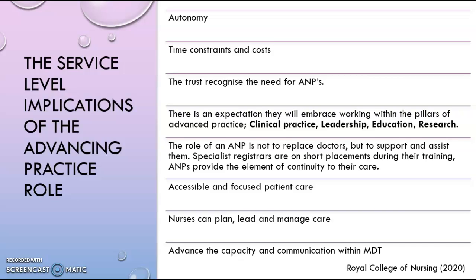The availability of ANPs in the day-to-day running of fertility clinics makes care easily accessible for patients, as the ANP can complete and assess the ultrasound scan. Additionally, on completing the ultrasound scan, the ANP can plan the next step in treatment with the patient, ensuring that care is patient-focused. They can discuss their recommendations with other ANPs without requiring a doctor to attend. It is important to emphasise that complex issues can be discussed with members of the multidisciplinary team. Furthermore, an experienced ANP can enhance MDT working, as in the absence of a doctor they can make clinical decisions in patient care with advice from embryologists.